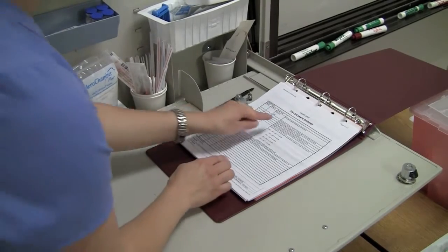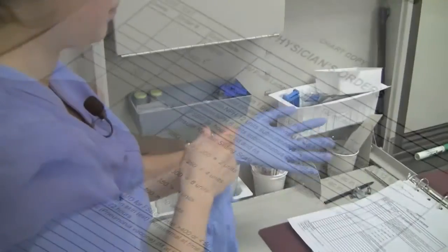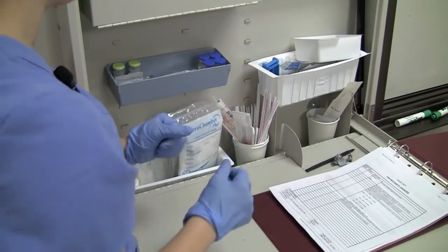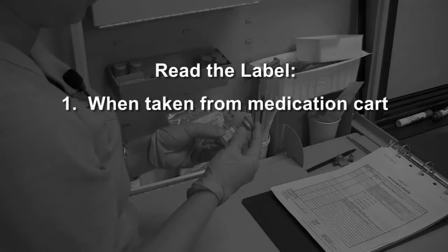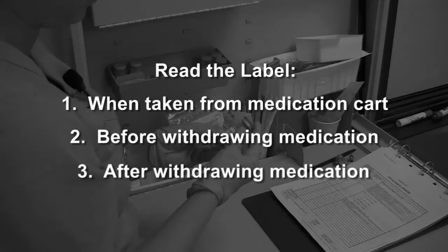Confirm the insulin dose with the physician's orders and the MAR. Read the label three times: when it is taken from the medication cart, before withdrawing the medication, and after withdrawing the medication.